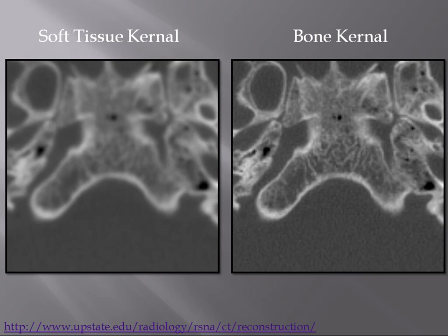Here we have two images side by side from the same acquisition but reconstructed with different filters. On the left is the soft tissue kernel, and on the right is the bone kernel. On the soft tissue image, you really lose the detail of the bony trabecula at the base of the skull. On the bone kernel, the fine septations of the trabecula are very perceptible, and you can see fat density areas between the trabeculations — superior spatial resolution. The bone kernel image does show a more pronounced quantum mottle pattern across the whole image, so there is a little trade-off.